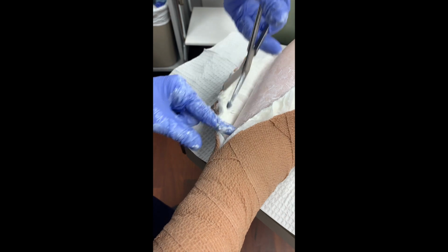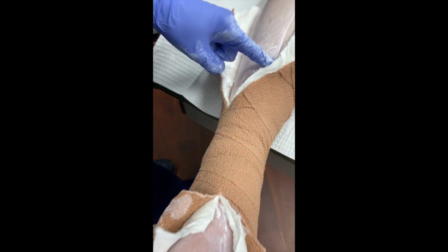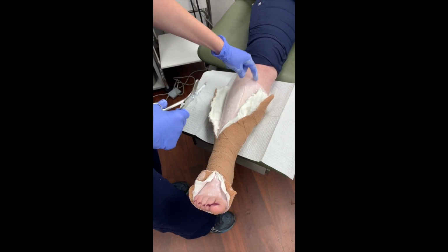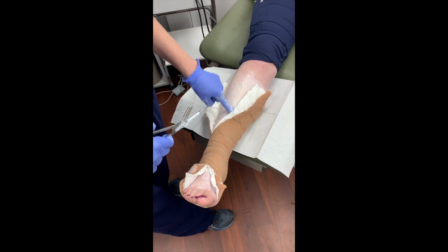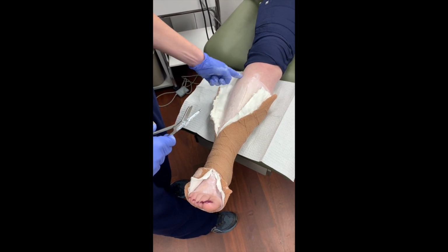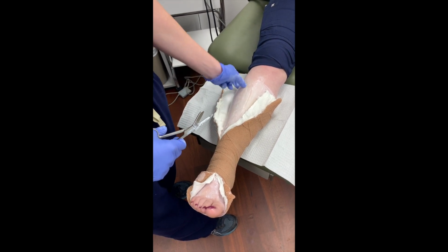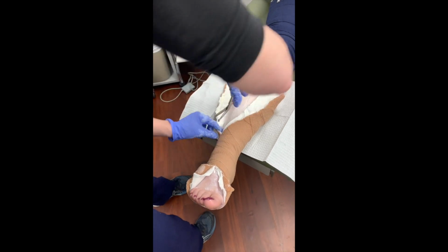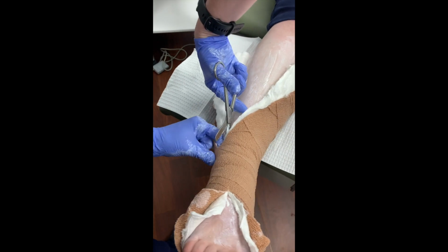Just slowly work your way down. You'll find landmarks you want to be cognizant of. Your tibial crest is right here. You don't want to come down centrally because your tibial crest is right there, and you don't have a lot of soft tissue coverage over it. The lateral side, your lateral leg compartment, your peroneal tendons and peroneal muscle bellies, allow for a little better tissue coverage instead of trying to cut off a dressing right over the bone.